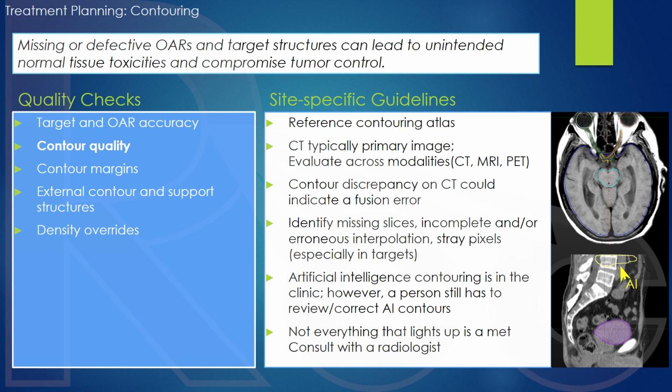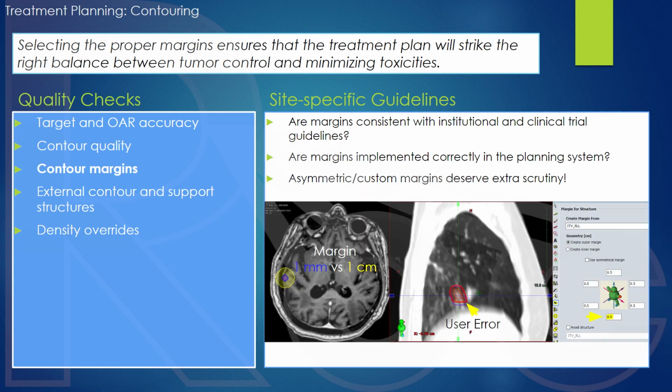Okay, what about contour margins? Selecting the proper margin is important to ensure that the treatment plan will strike the right balance between tumor control and minimizing toxicity.